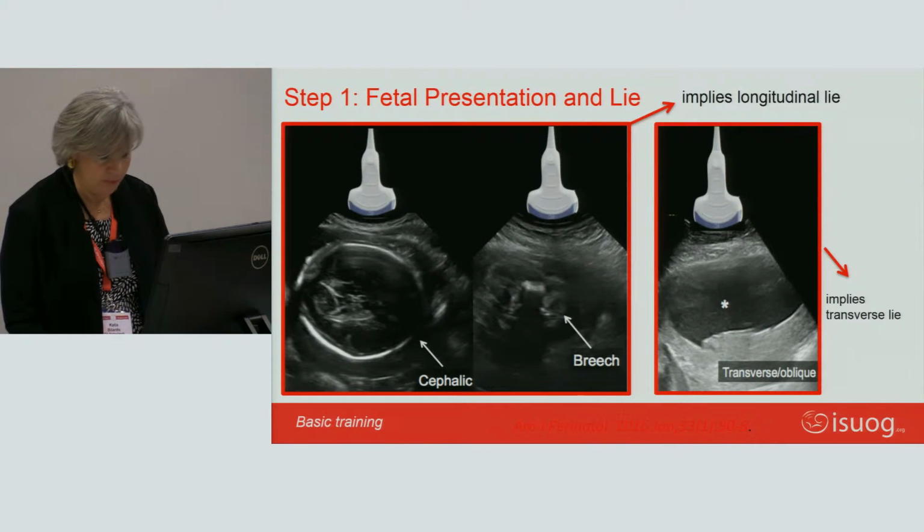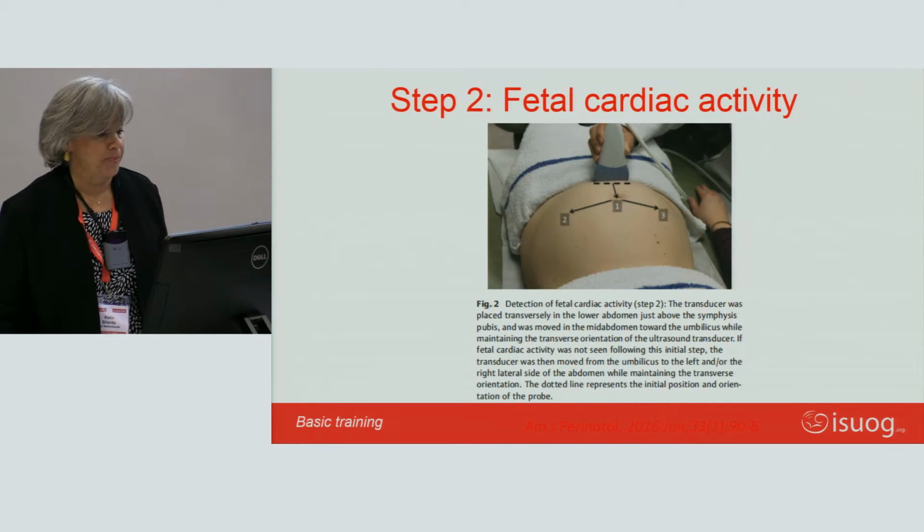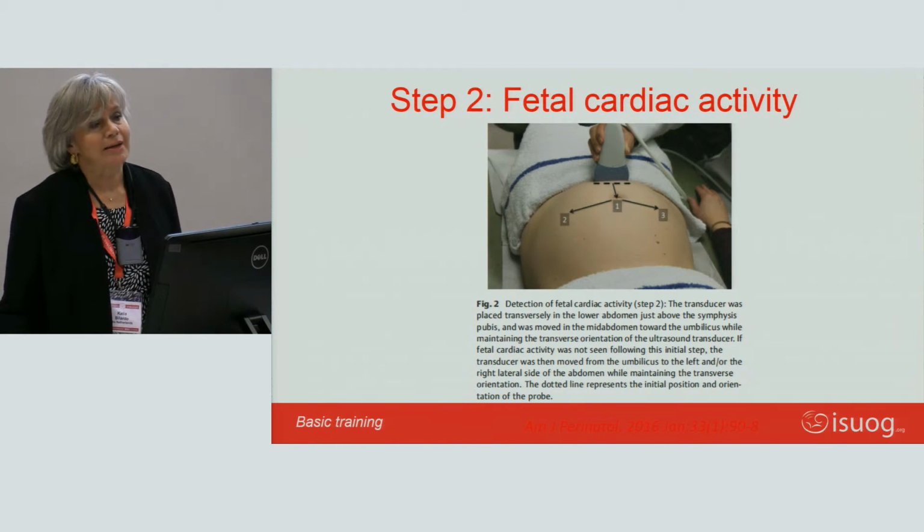Why doesn't it want to move? Okay. And then the second step, which is assessing cardiac activity.